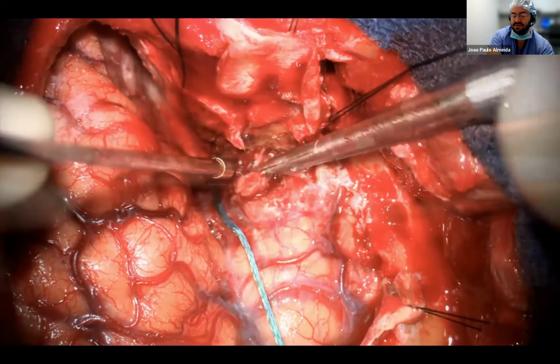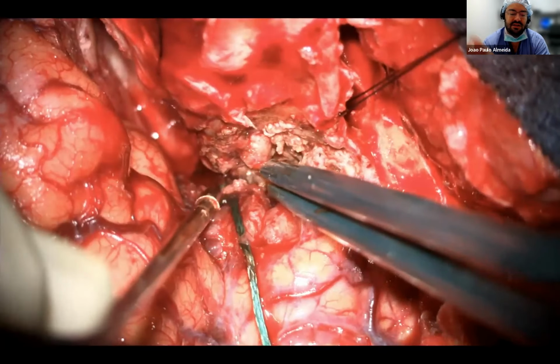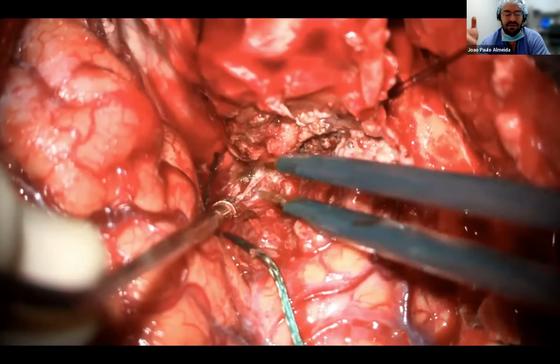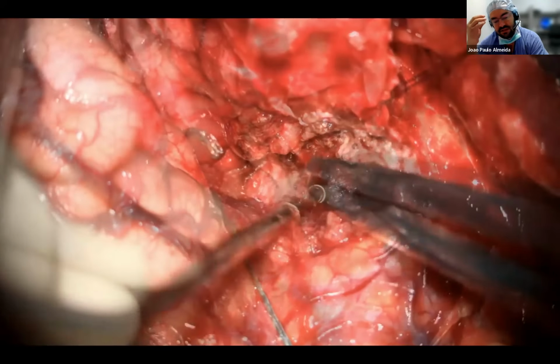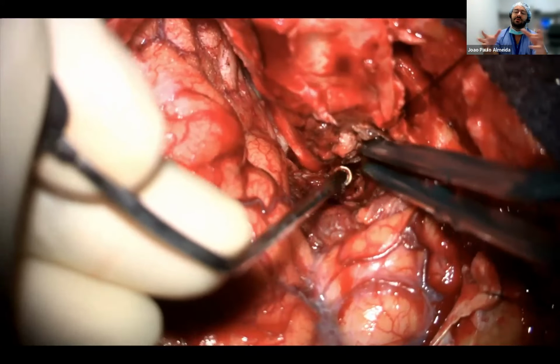So carotid cistern, just so I know where the carotid is, drain CSF. And then after that, the next step is really to debulk the tumor towards the middle fossa. So that's what we see that we're doing there. So just going aggressively because we know there are no branches in that space. And with aggressive debulking and decompression, that tumor is going to get smaller and smaller and smaller.